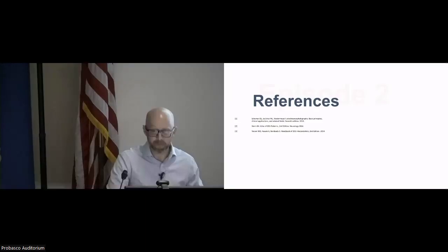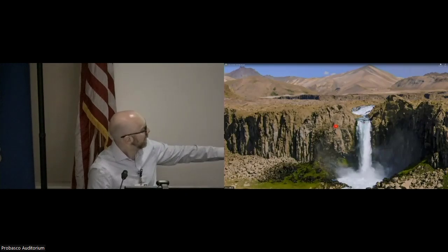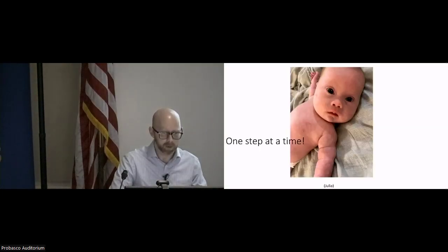Yeah. So long story short, before you can do this, there's a guy running a waterfall here in a kayak. Before you can do that, you need to learn the basics, right? The more you solidify these basic concepts, the more comfortable you're going to be. We all come across EEG, especially inpatient. It's like the one thing we really do procedure-wise anymore inpatient. So I think it's good to have at least some of the basics down, and we'll keep working on it.